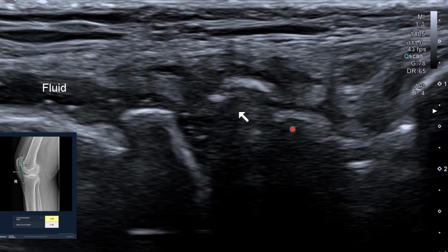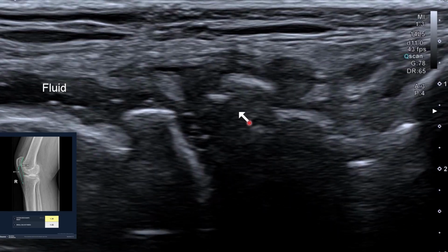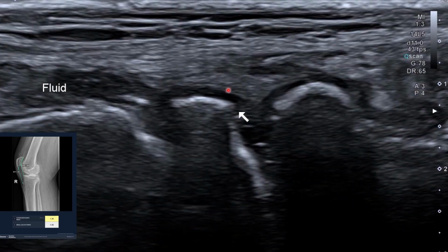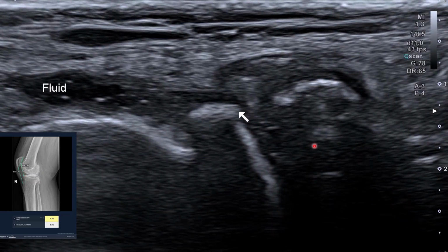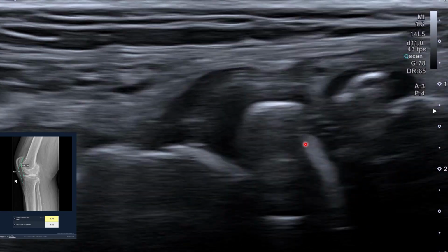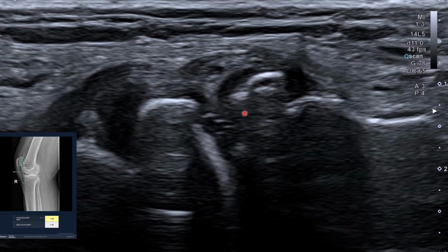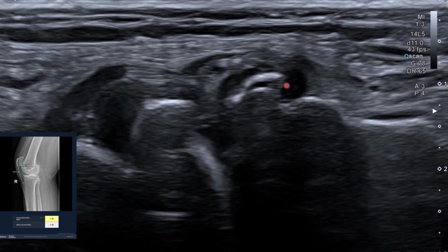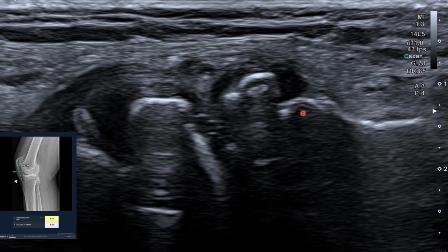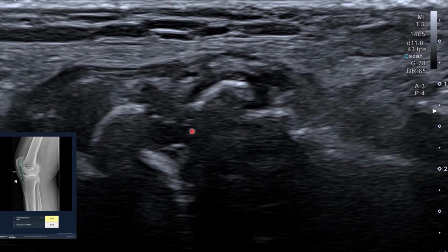But at times for these superficial structures and foreign bodies, I prefer to use a hockey stick. So the hockey stick is the best boy for the job. I need you to appreciate the difference and see how well the hockey stick can achieve its objectives. Yeah, so there we go again.